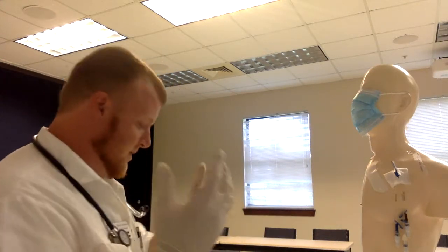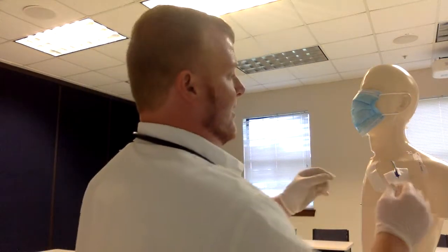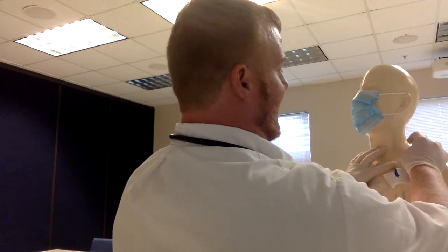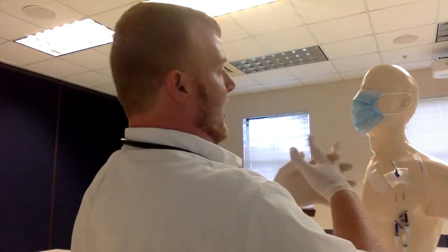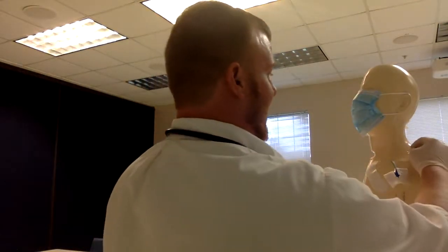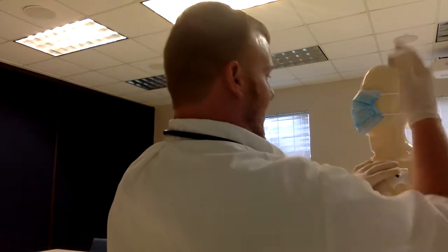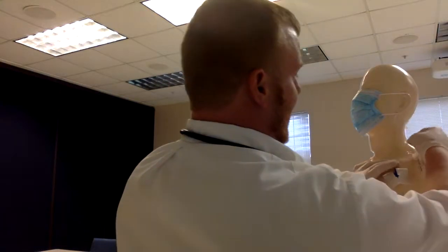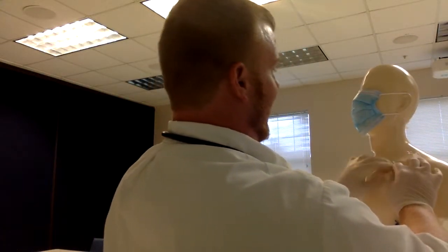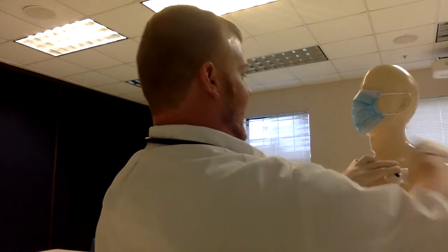With clean gloves, I'm going to start here and peel from the outer edges, holding the catheter, and throughout the whole process, making sure that the patient knows what you're doing. They're not just jumping into it. So, Miss Sally, I'm going to take this off. I'm peeling all the outside edges off, loosening up gradually and not just forcing it off.